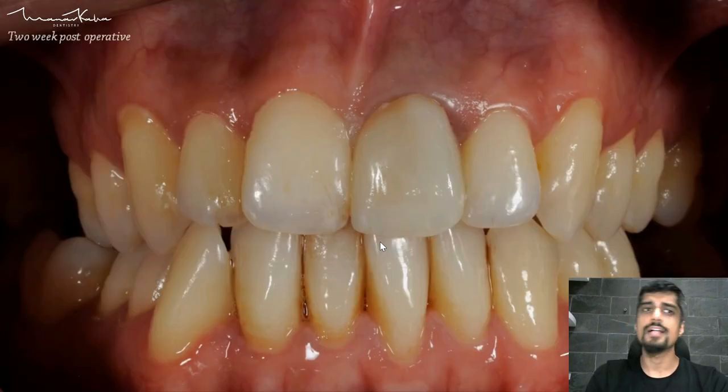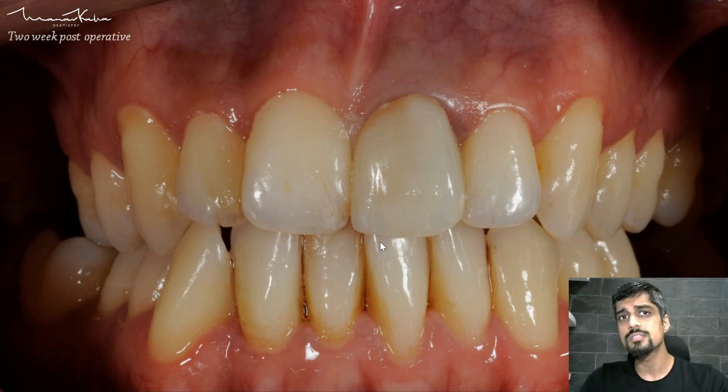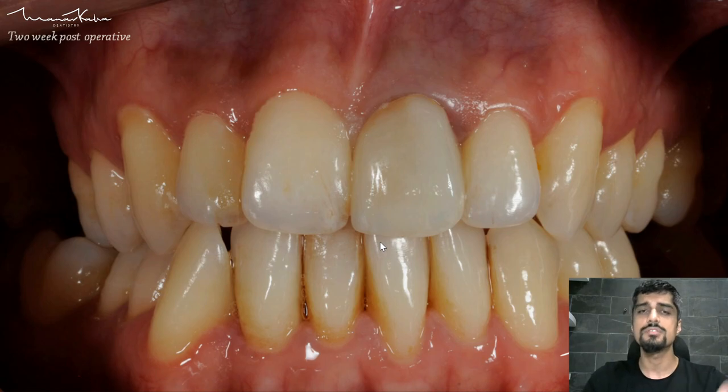This is the final post-op — actually two weeks post-op after the gingiva has healed, because with sub-gingival margins there will be some amount of damage to the gingiva on the day of cementation and cleaning. The final result — not too bad — but obviously there is still some difference between the two teeth. Central incisors are a very, very big challenge for our technicians.